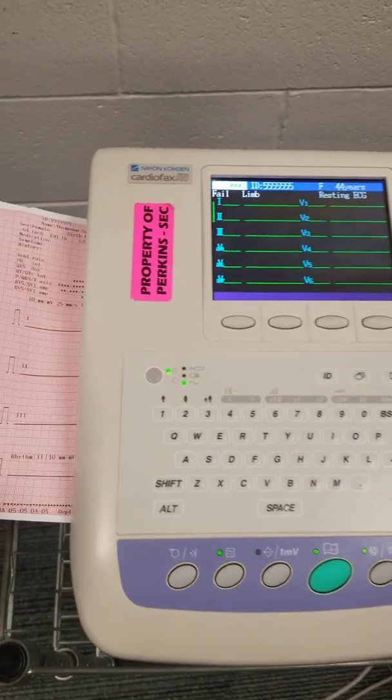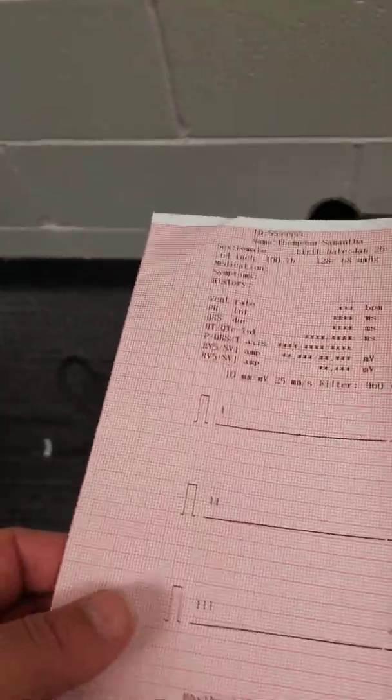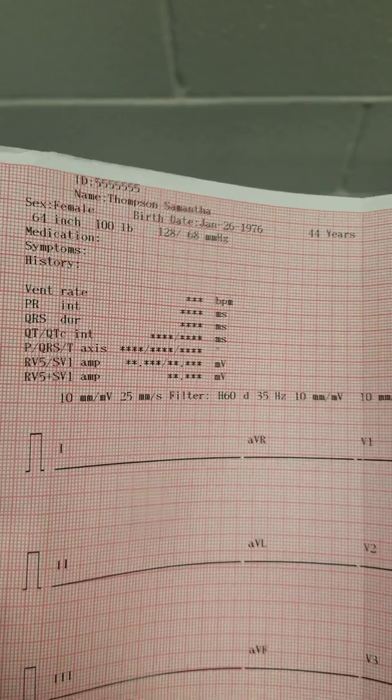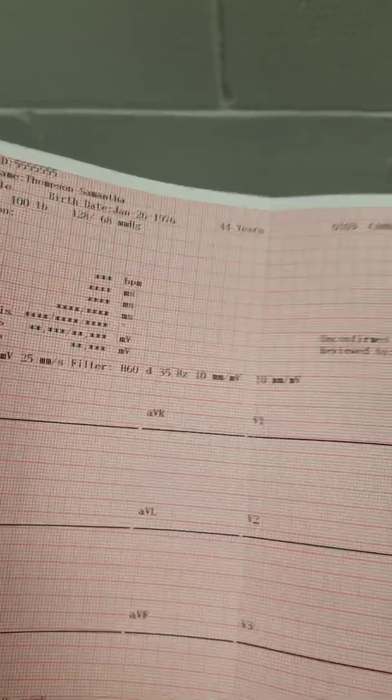So now it's going to print. I can see on here when it prints I get all of that data that I typed in. I also get some more information. Of course, this one is blank because it's not hooked up to something.